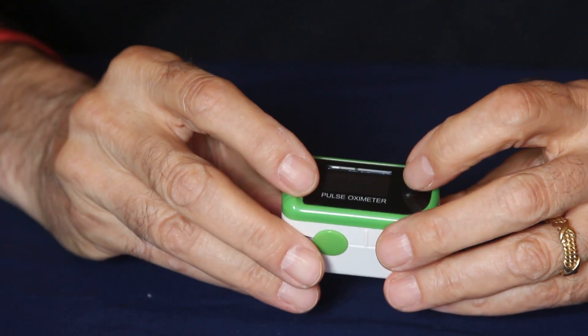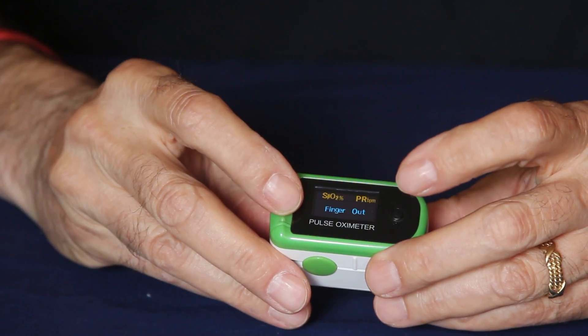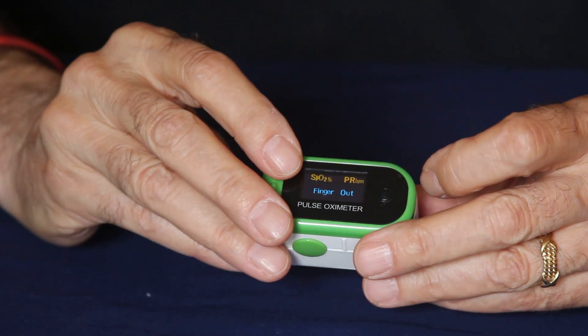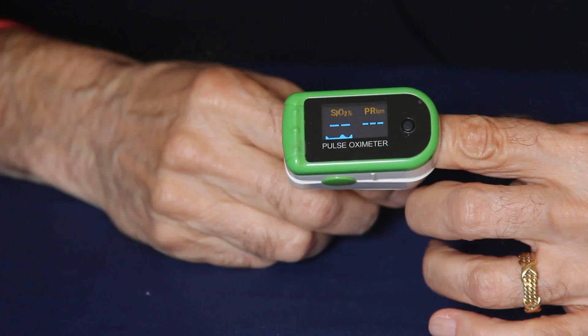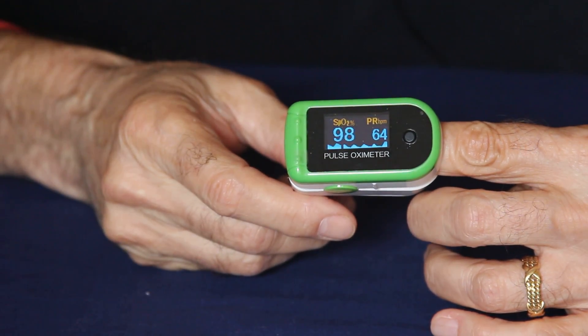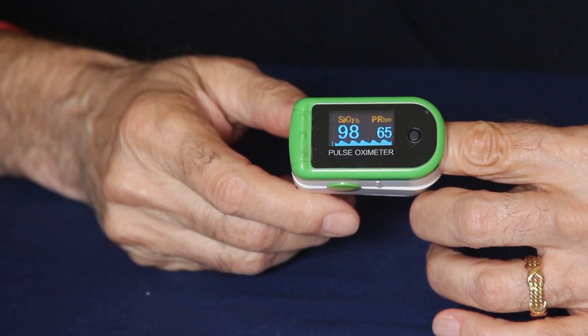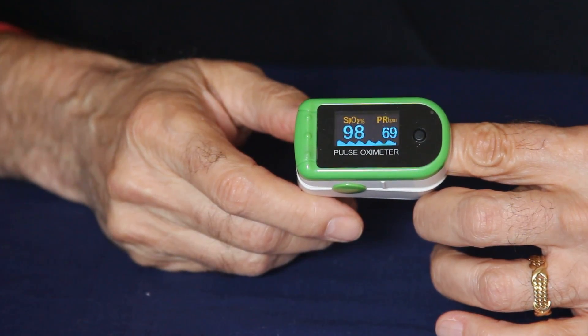To use the SpO2 or pulse oximeter, simply push this button here. It's telling me 'finger out' now, which means there's no finger in there. I'll insert my finger — it's telling us that I have a 98% oxygen saturation level and my heart is beating around 66 beats per minute, which for me is normal.